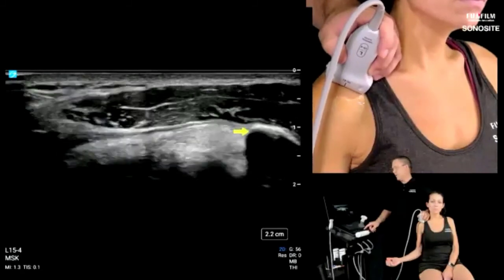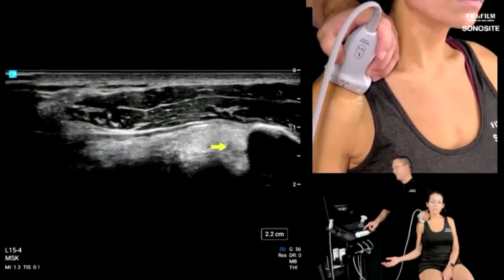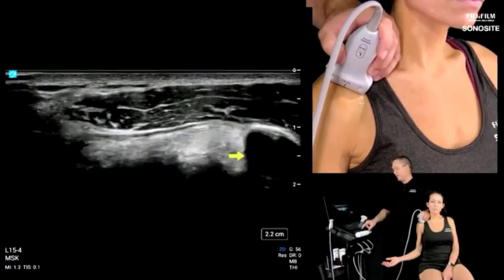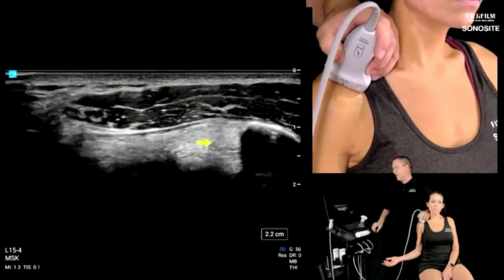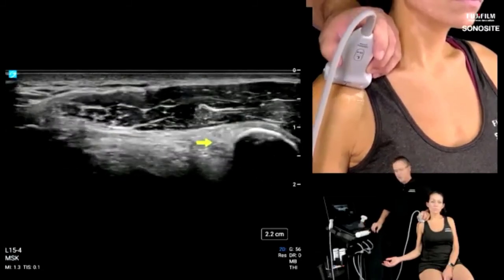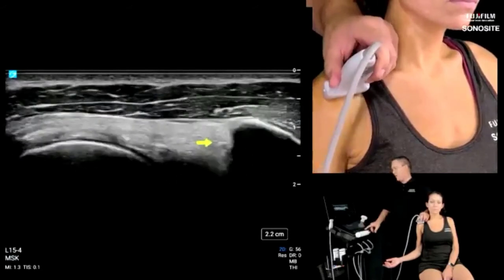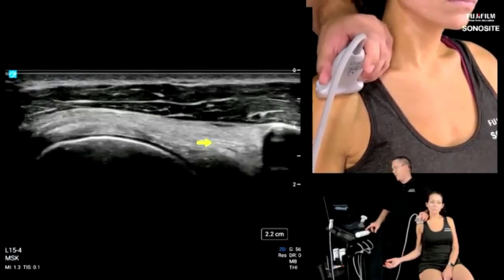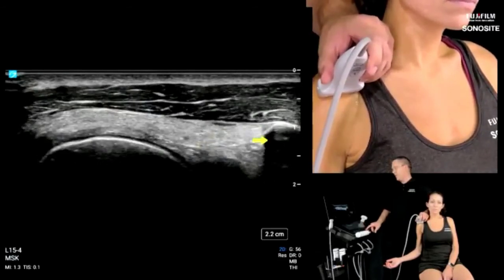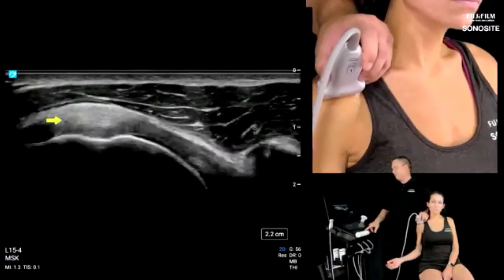So here we have the coracoacromial ligament, and then underneath this little spot, obliquely coming in from the other side of the coracoid, this rounded structure is a transverse coracohumeral ligament, and we can elongate that as it drapes over to the greater tuberosity and overlying the biceps at the interval. So there's your long axis coracohumeral ligament also. Great.